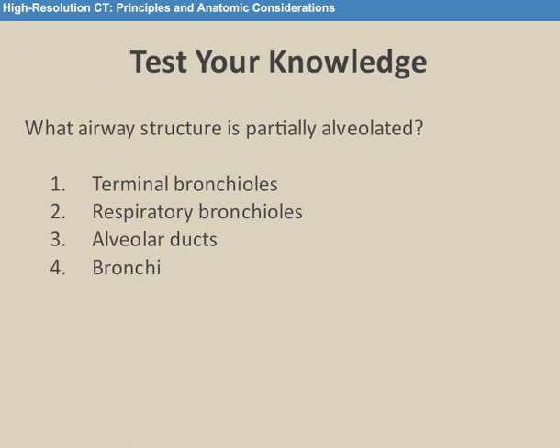Now we're down to the small airway level in that illustration. So is it a terminal bronchiole, a respiratory bronchiole? Is it the so-called alveolar ducts, or is it the bronchi? So respiratory bronchioles are partially alveolated.